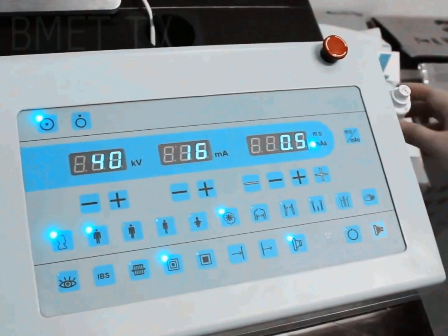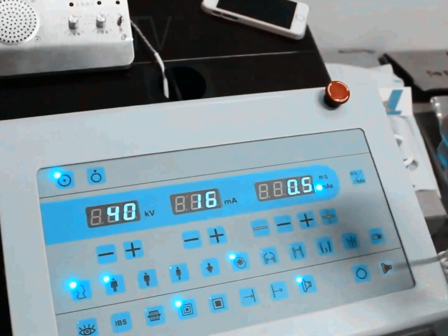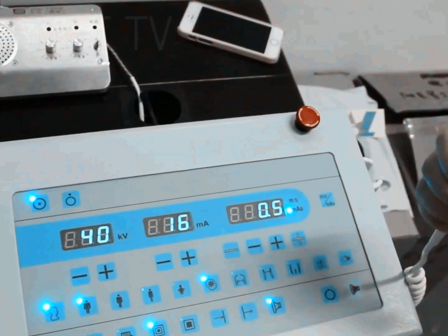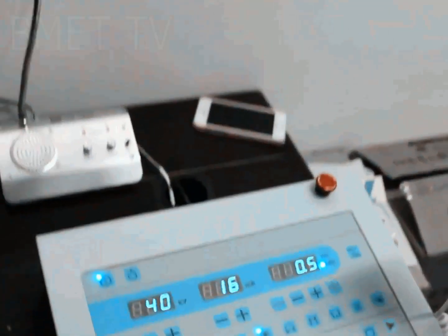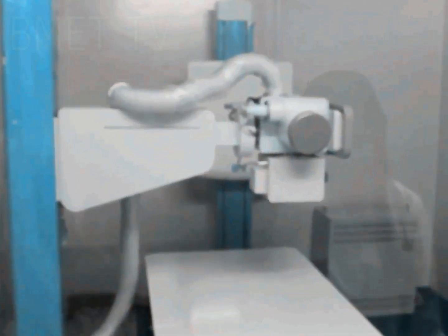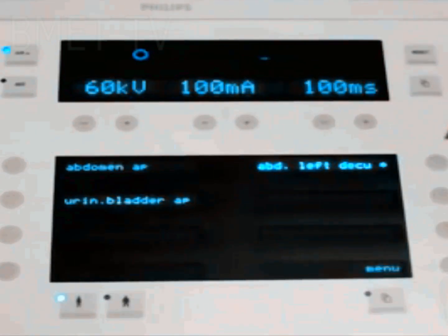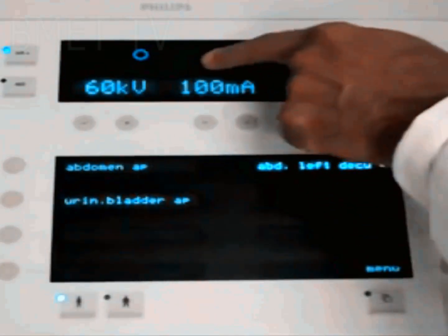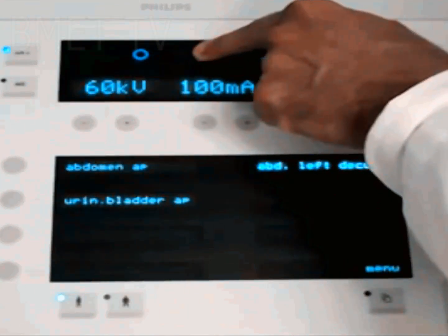More radiation will cause more photons reaching the detector, and hence apparent structural density will increase, as the signal intensity will increase. The time factor is a measure of the electron's production duration in the tube, meaning it prescribes how long mA will last. The reciprocity law states that the reaction of photographic emulsion to light will be equal to the product of the intensity of that light and the time of the exposure. This law pertains to mAs in the sense that all combinations of mA and time that amount to an equal quantity will produce the same amount of density.